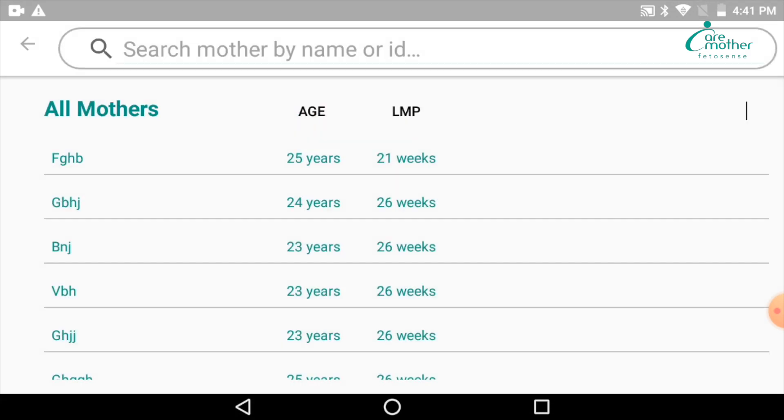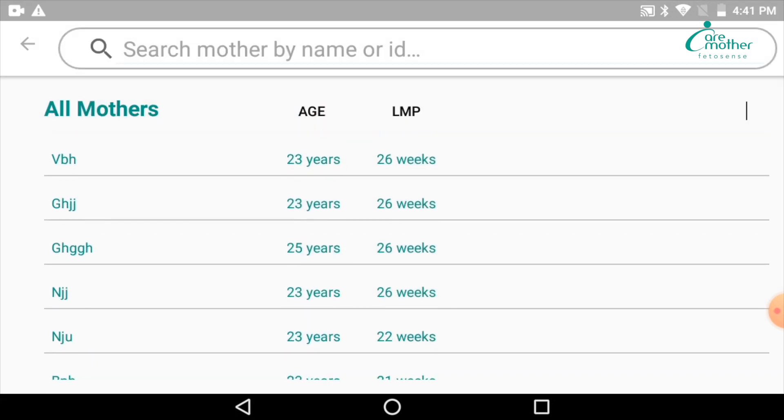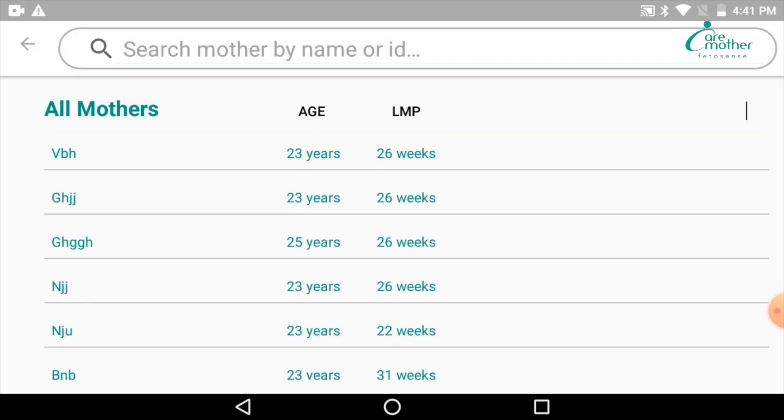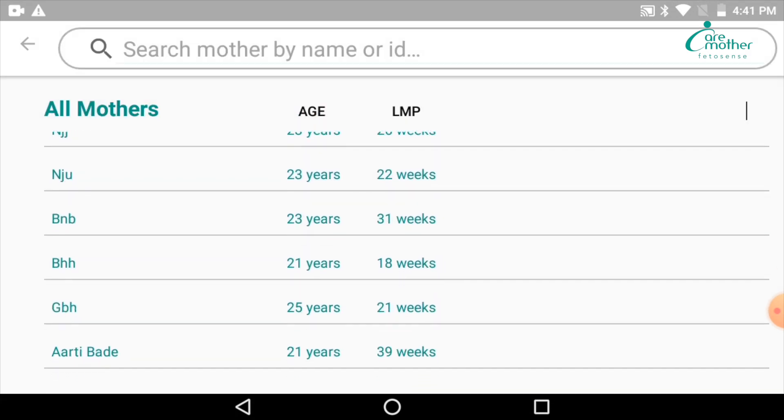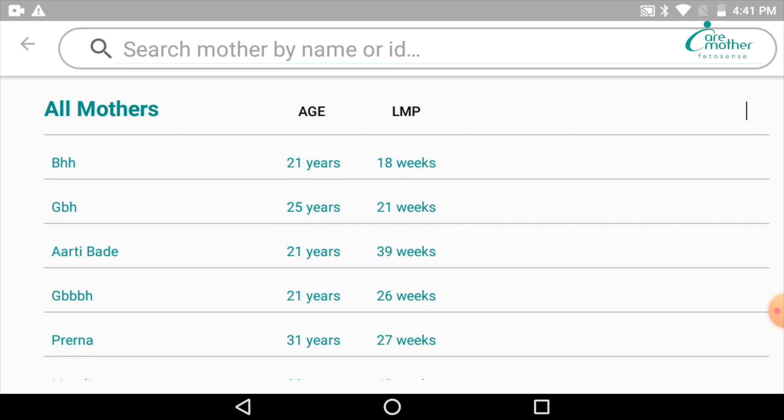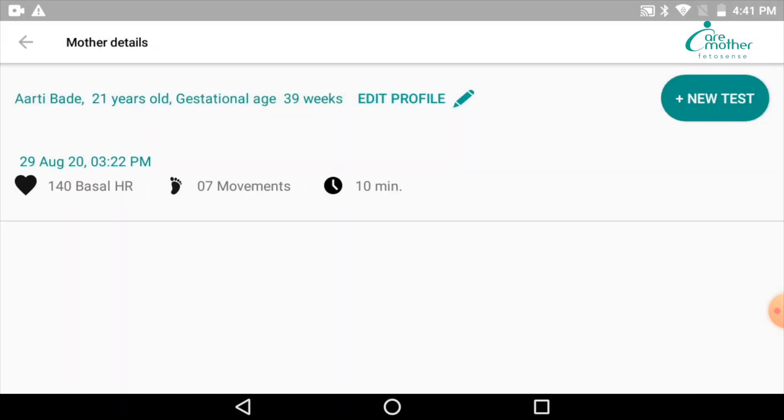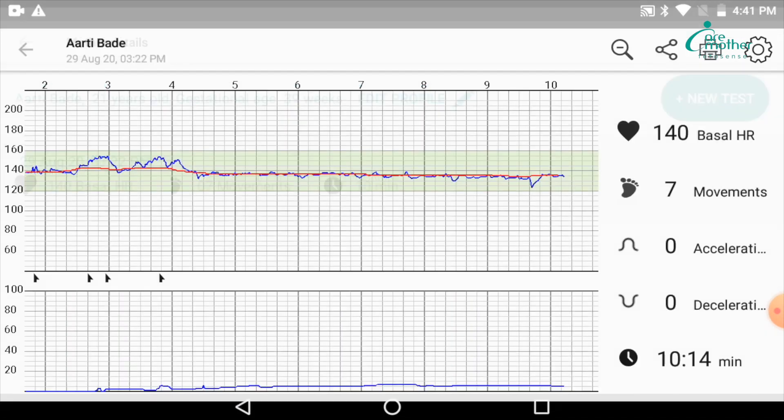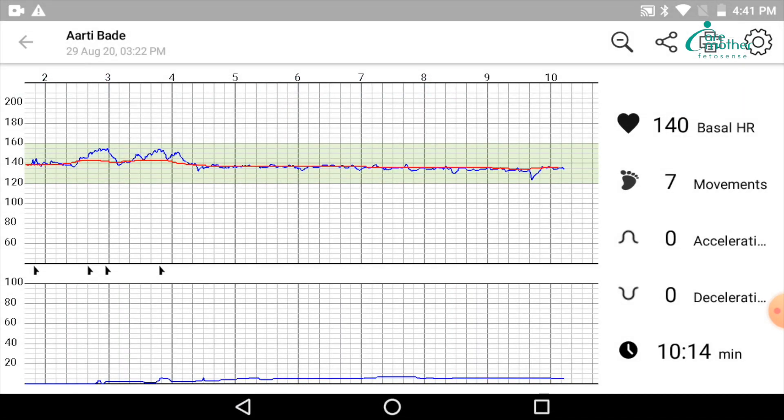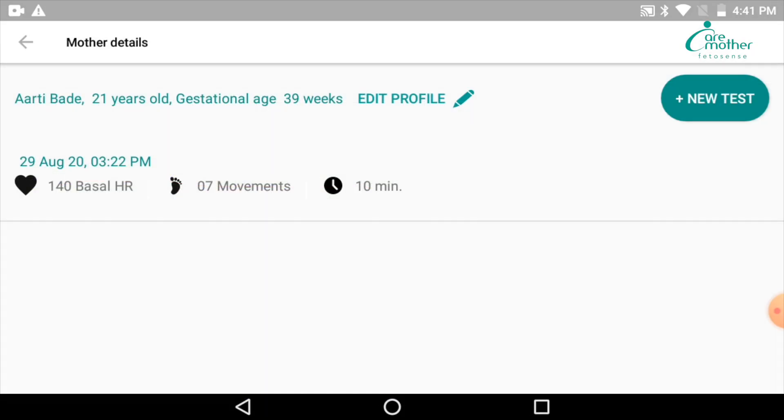This device is capable of auto-interpretation. You would be able to see the auto-interpretation-based line, and the acceleration-deceleration counts will also show up.